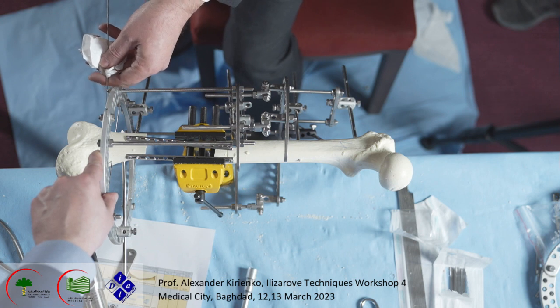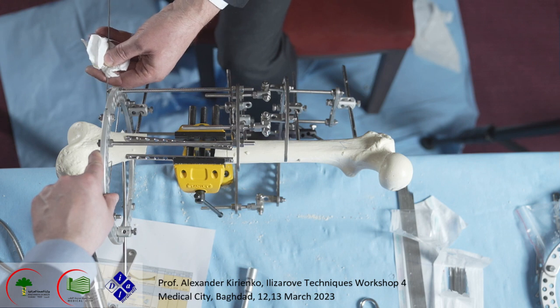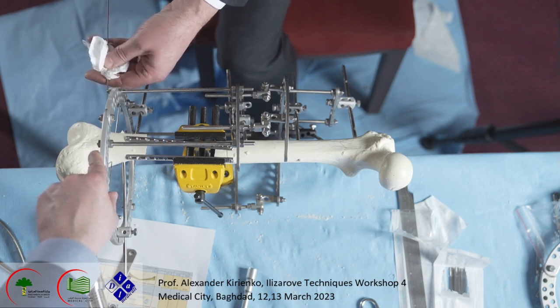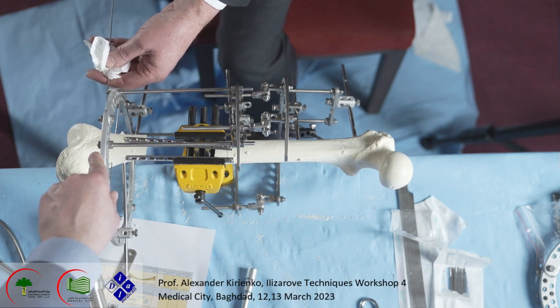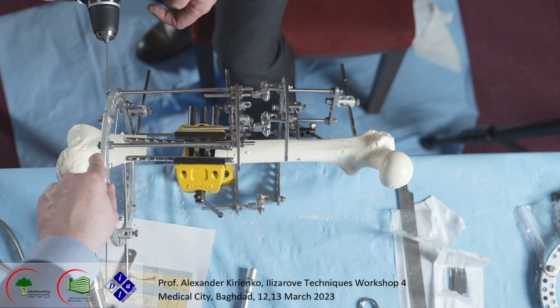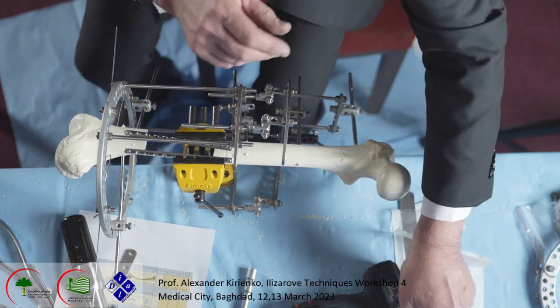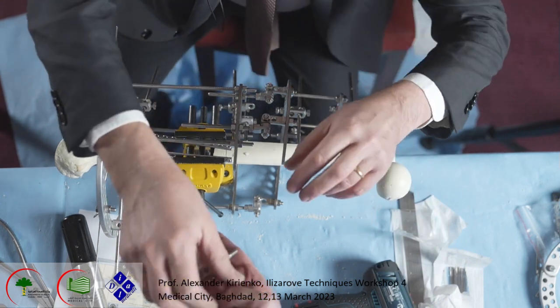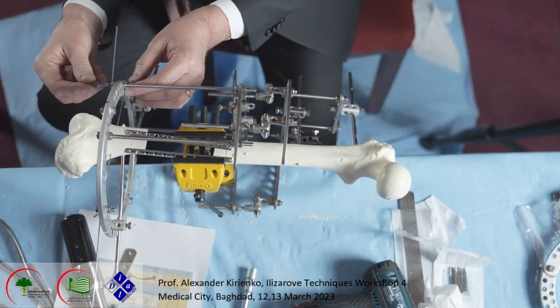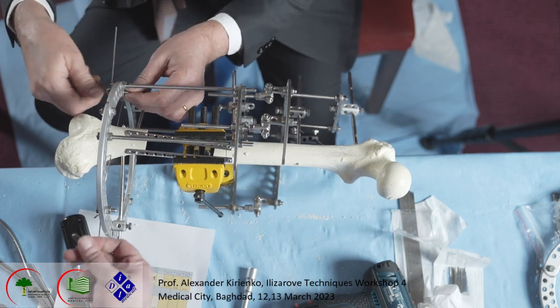We may put like this. Okay, I distance it again from the rod, and we will fix the wire with this male post, like this or like this.